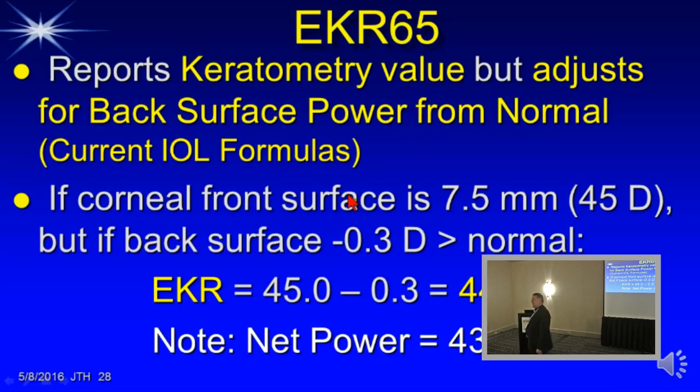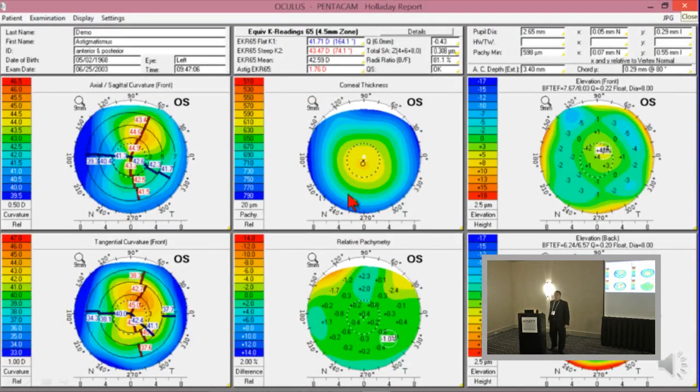If you pick that with the EKR65, you'll end up with your patients being 0. You want to end up targeting them to have a quarter of a diopter with the rule, if using the EKR65. That's all that means. Okay. And I'm just pointing out that you would use a half a diopter if you weren't using this one.